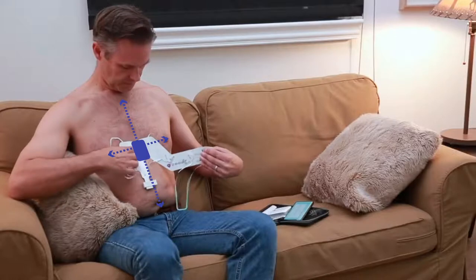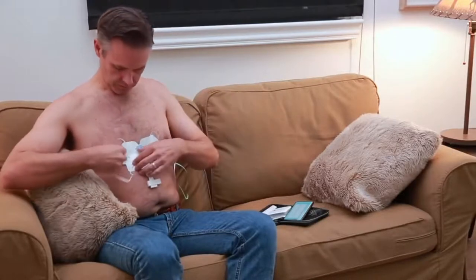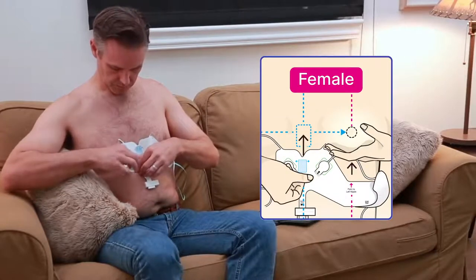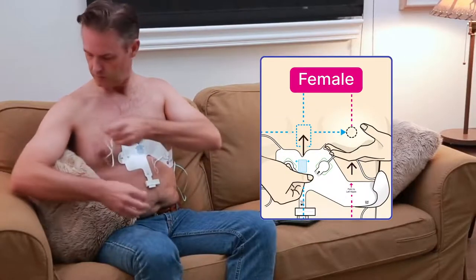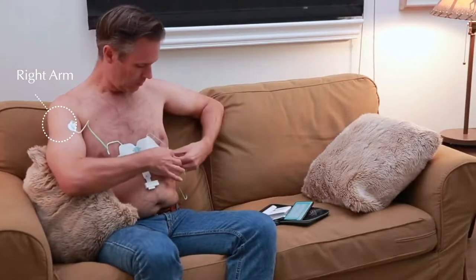First, position the blue box at the center of the chest between the nipples. Then wrap the strip around the left side of the chest. For women, the strip should wrap around the underside of the left breast. Pull the lead marked right arm and stick it to the right arm.